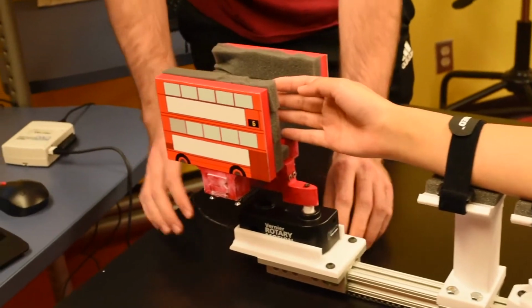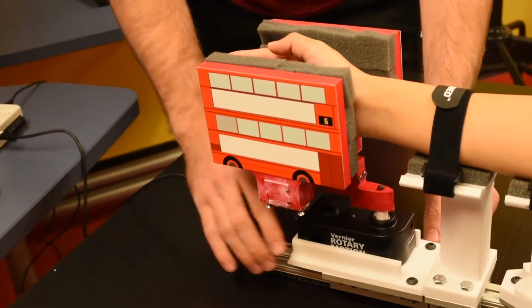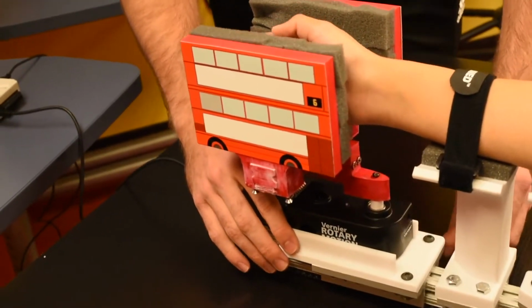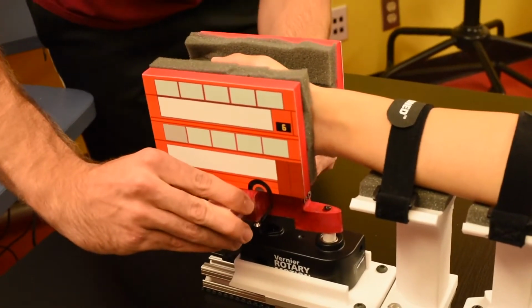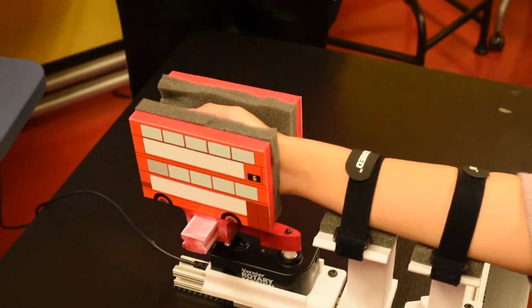And we're going to use this handbrake to position the hand clamp in the perfect position to where the rotation is right at the wrist joint. And so once we're happy with that placement as well, we'll lock that in place. And then we will undo the locks on the hand clamp, make sure that it's nice, secure, and snug, and then the patient is ready to start the trial.